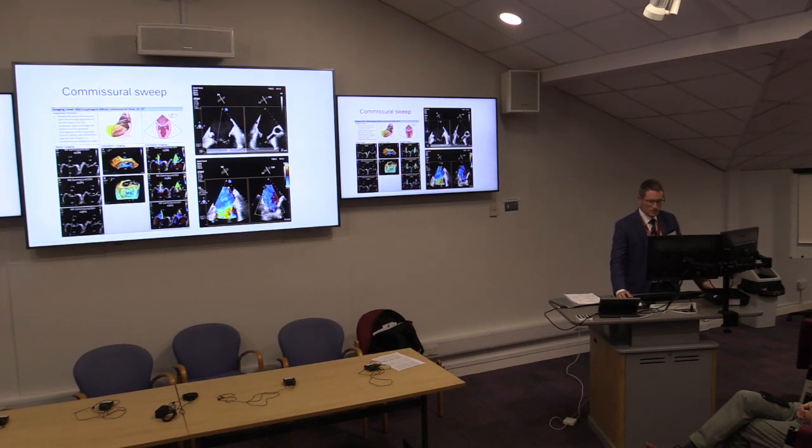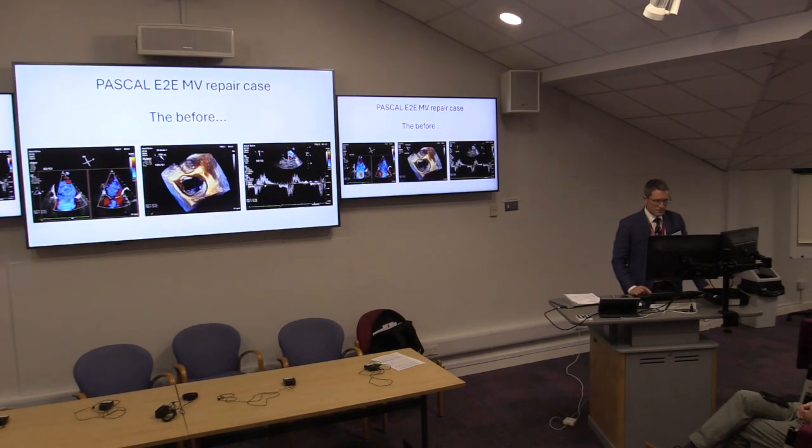But this is a nice example of severe MR secondary to a P2 flail. So this patient actually was deemed too high risk. I think the patient was in their late 80s. They had quite bad emphysematous lung disease on top of this.